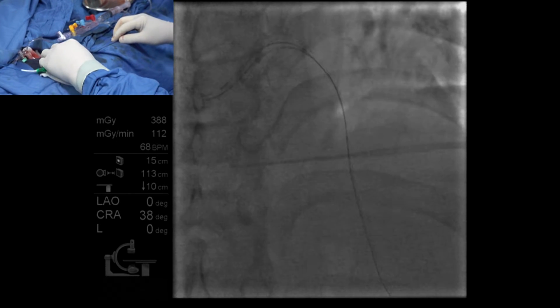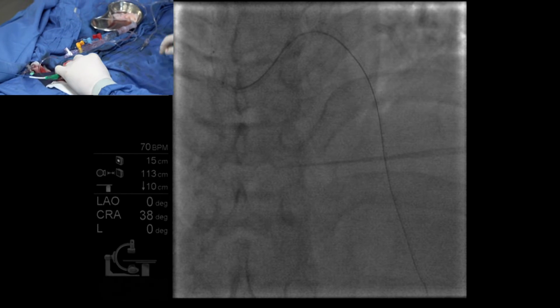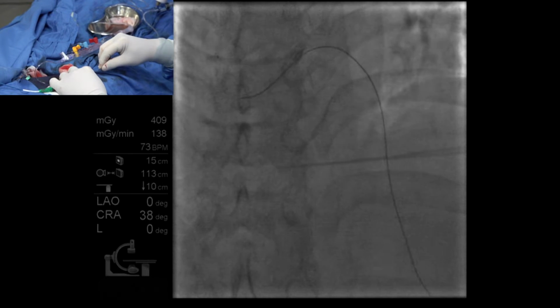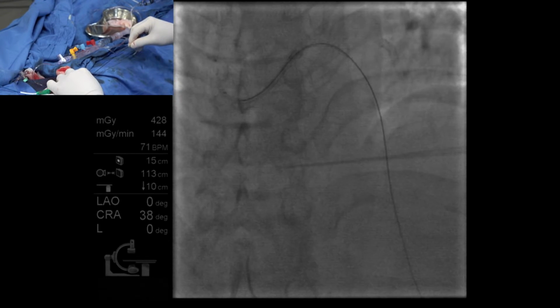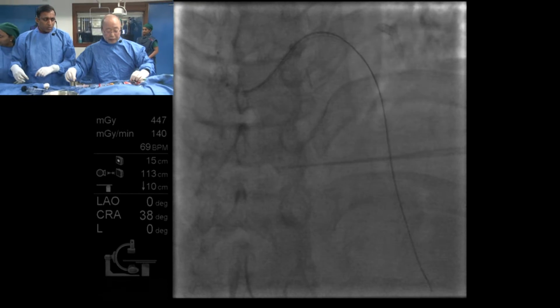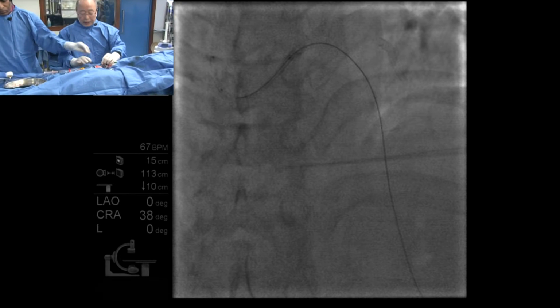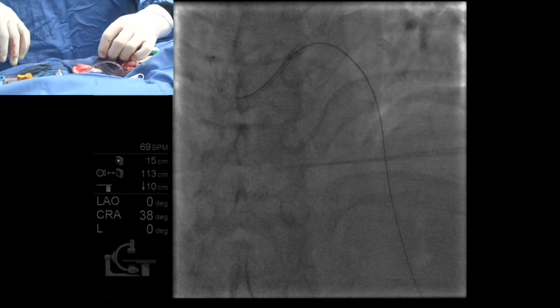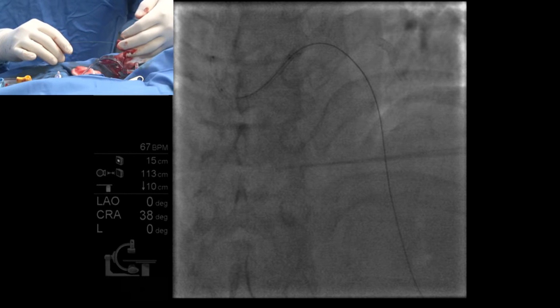Yes, please. Okay, this is anchoring the wire within the guiding catheter. So by keeping this maneuver, I can safely remove the microcatheter while keeping the wire still in position. I'm pulling back the microcatheter. It's a safe procedure. However, it is better to do everything very slowly. Okay, now I got the wire. Next, deflate, and I remove this anchoring, trapping balloon. Then I wait for the blood to come back.